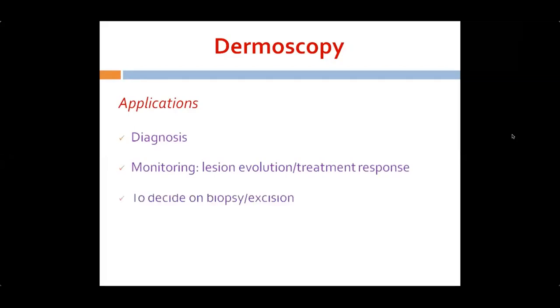So what are the applications of dermoscopy? Basically, it is a diagnostic tool, but it can also be used as a tool for monitoring lesional evolution or even treatment response. And this is a very important application of dermoscopy: to decide on biopsy or excision. This is of relevance, especially in malignancies. Dermoscopy can detect abnormal changes at a very early stage and prompt you to carry out a biopsy or excision.